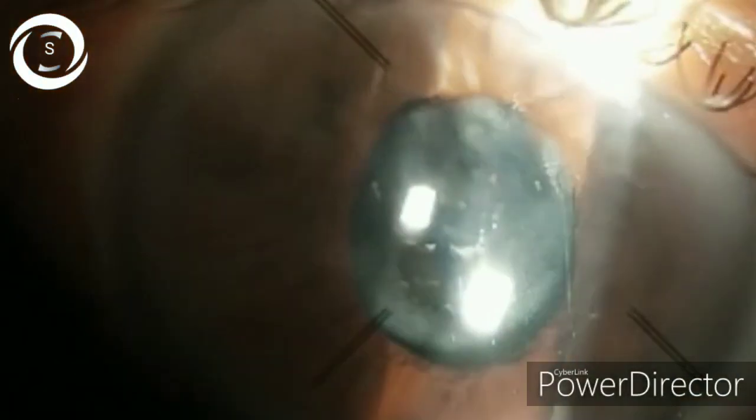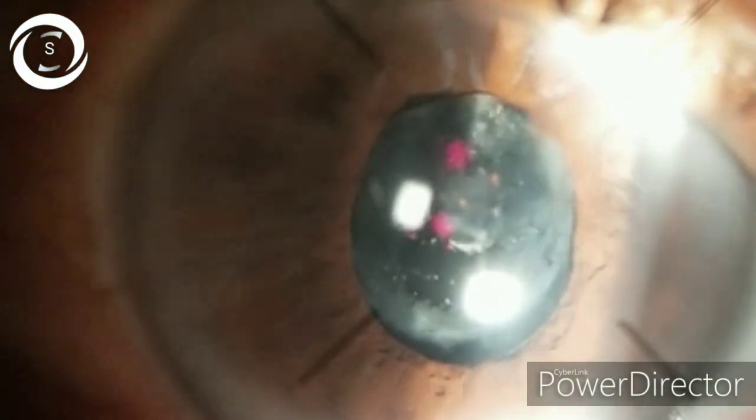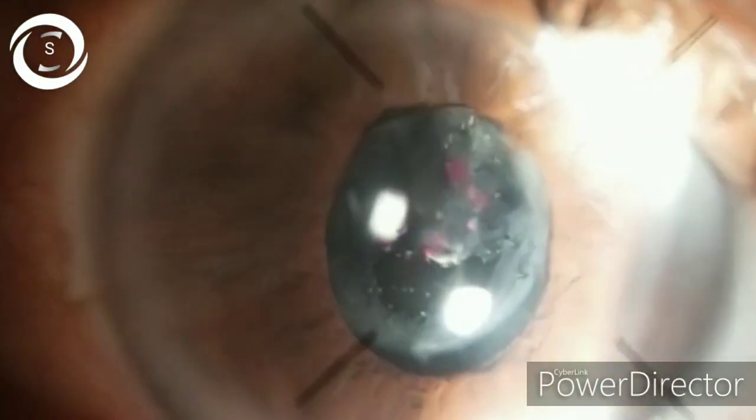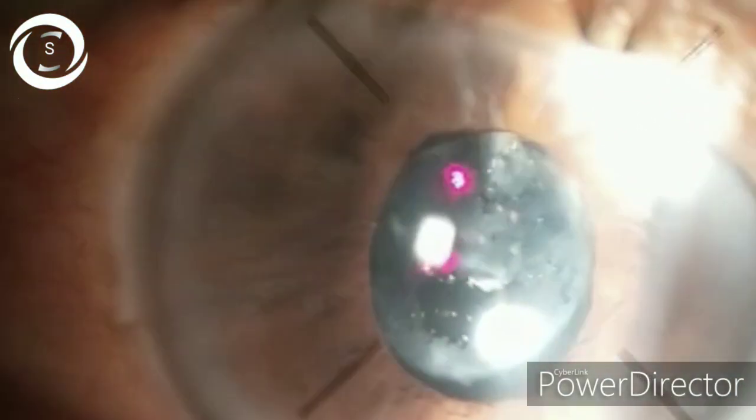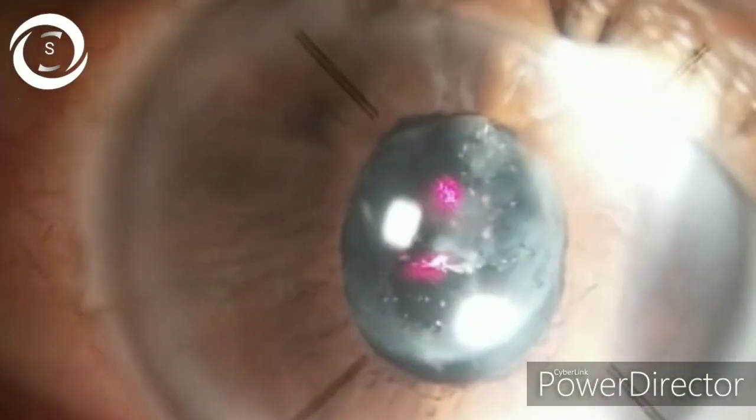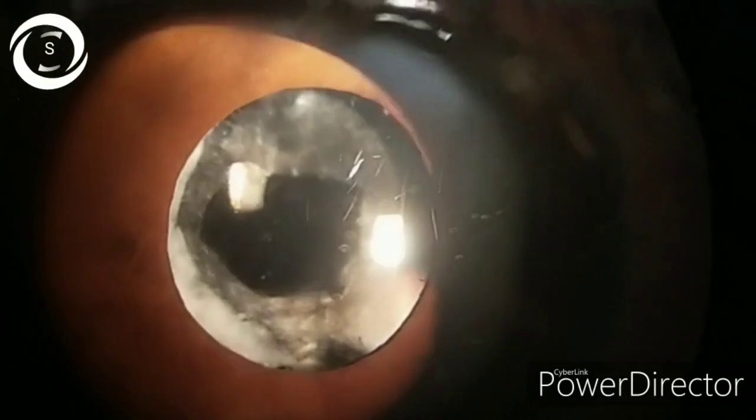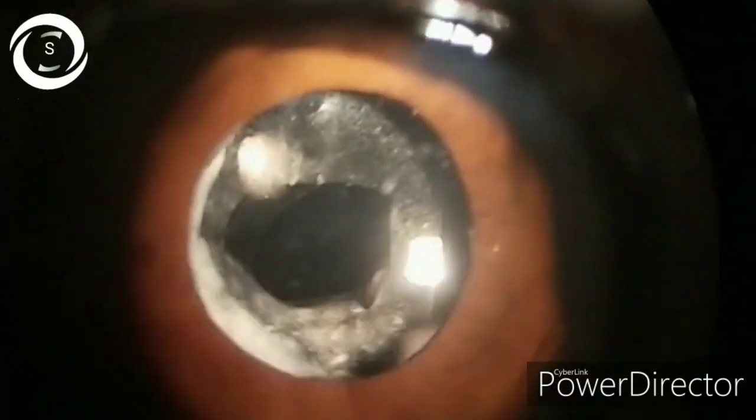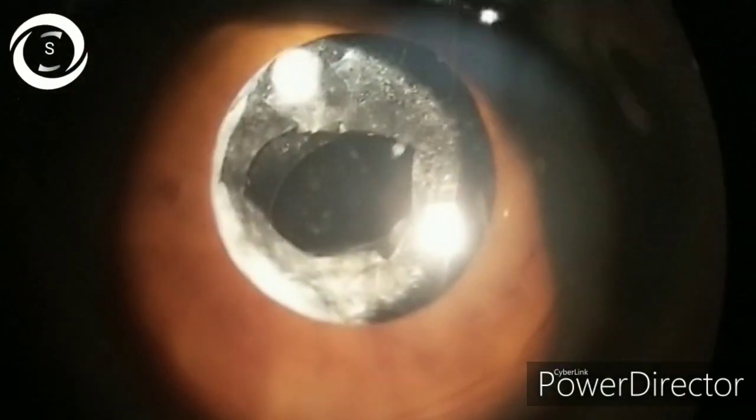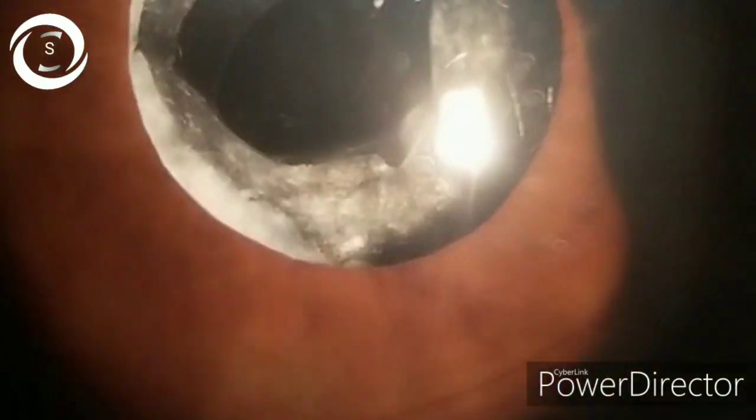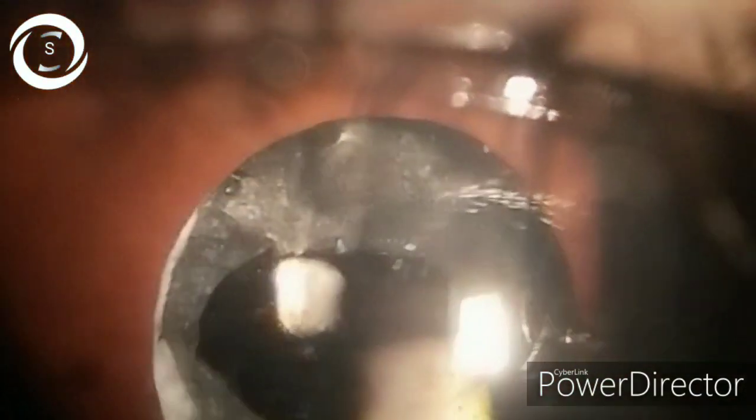For already formed PCO, we perform Nd:YAG laser posterior capsulotomy. Sometimes the PCO is too thick, and for that surgical capsulotomy is required. Now how to decrease its incidence?